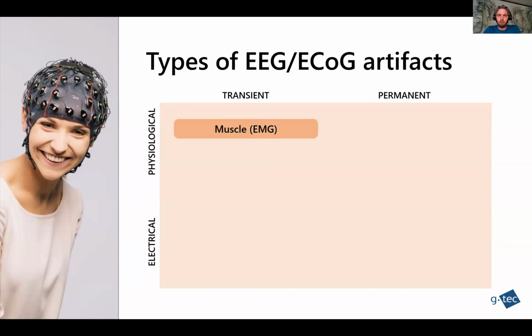So the most prominent artifact we are usually dealing with is EMG. It stems from muscle movement, and it occurs when you're actually moving your body while you're performing EEG measurements. This is a very common source of artifacts for EEG. Luckily, this doesn't happen in ECoG, because in invasive recordings you're under the skin, so you don't capture any muscle activity.